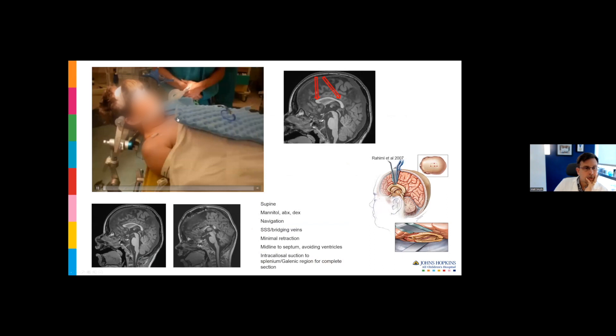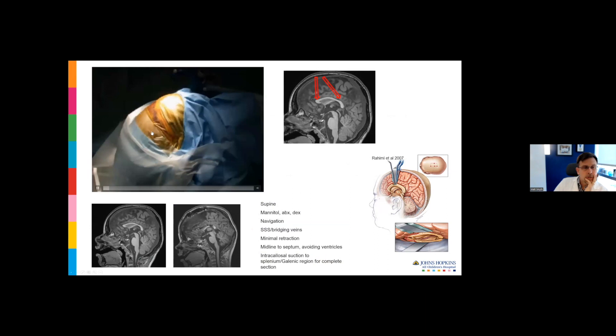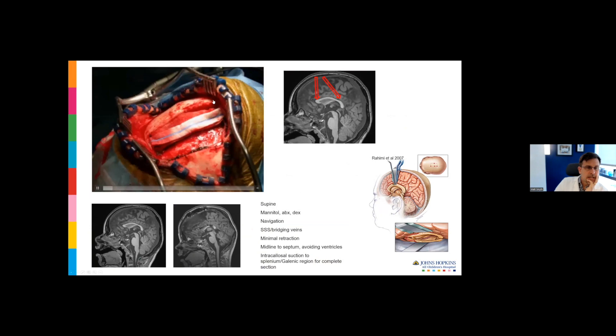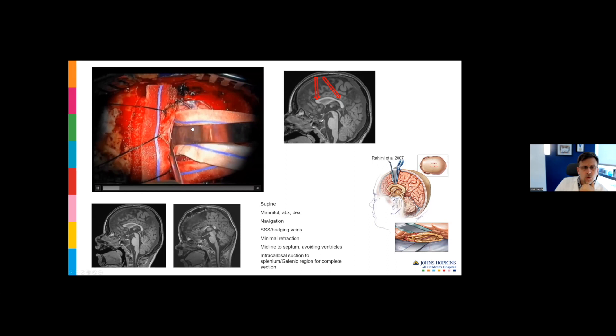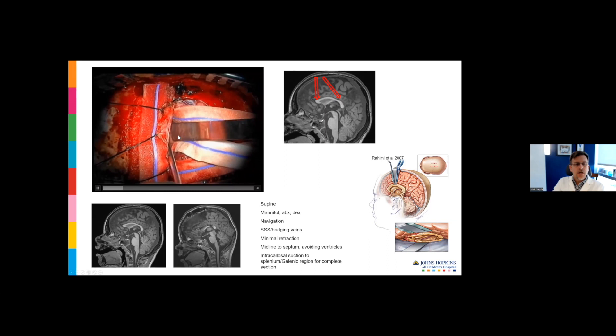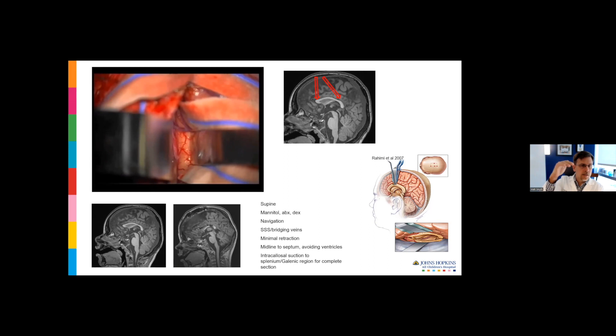This is a short video depicting the approach that I typically use for callosotomy. I like a supine approach. A craniotomy is half in front and half behind the coronal suture, crossing the midline. The sagittal sinus is underneath the gel foam here. I reflect the dura immediately, and I do incorporate a single frontal lobe brain retractor. I try to minimize retraction by gently aspirating the CSF, giving mannitol, gently hyperventilating, and keeping the head of the bed elevated.